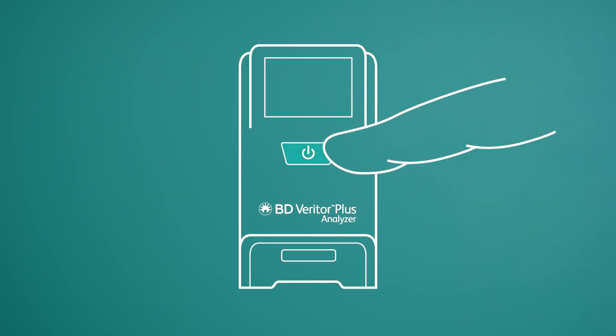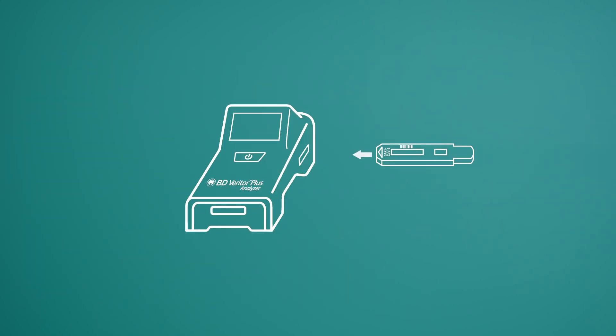Power up the BD Veritor Plus analyzer, insert the test device, and read the results. That's all there is to it.